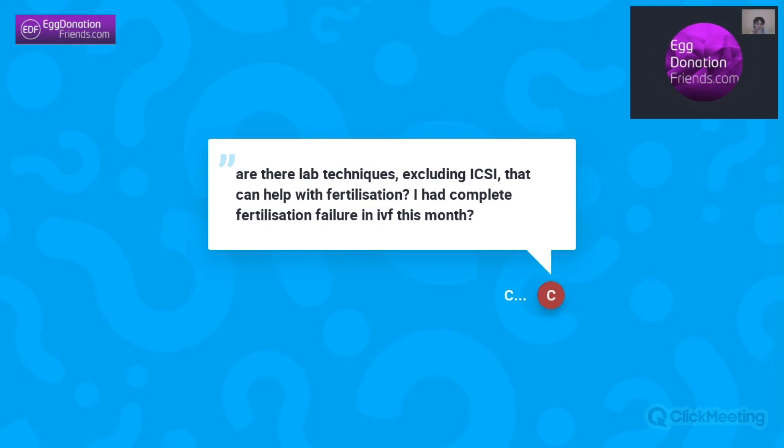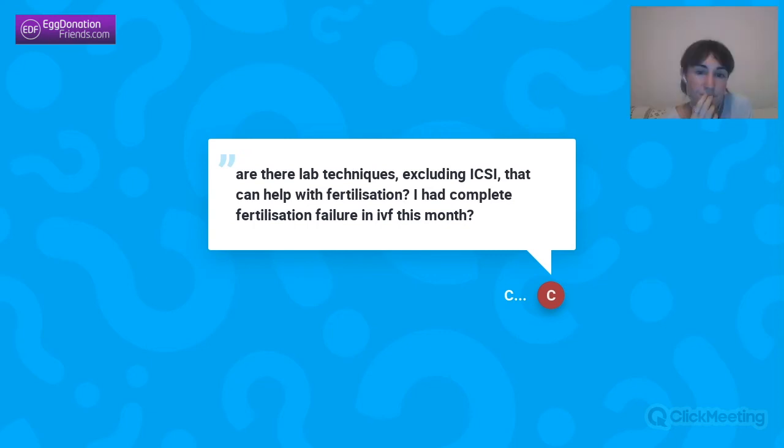Are there lab techniques, excluding ICSI, that can help with fertilization? I had complete fertilization failure in IVF this month. So this would be the kind of patient for which we could consider to apply calcium ionophore.